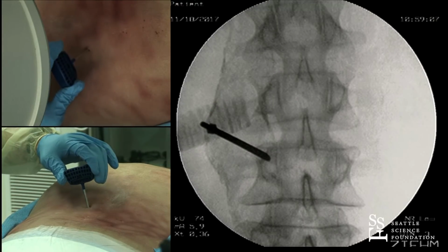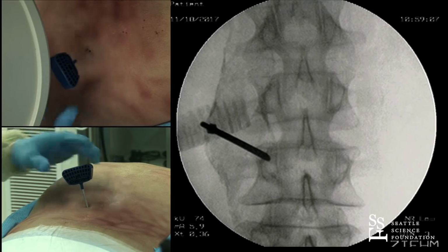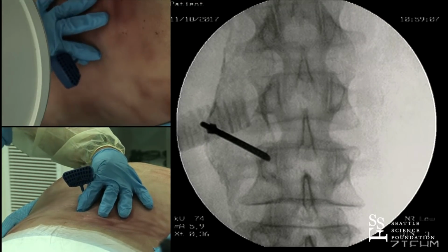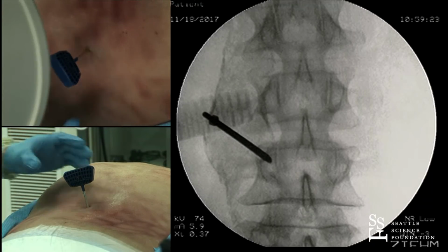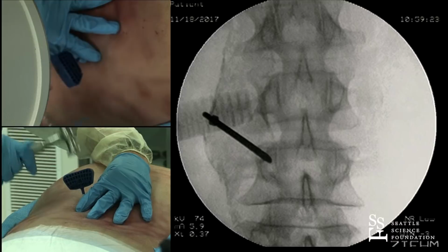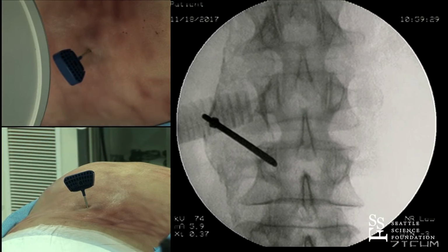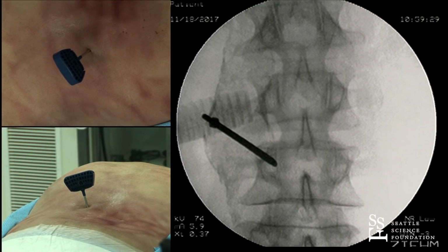So, Doug, for the audience, what are you trying to landmark there? In terms of the 10 o'clock position of that left pedicle, as we hammer this in, that's about the right position. I like that quite a bit. The cadaver is pretty hard. So before we violate the medial wall of the pedicle, we're going to go lateral to see if we're in the posterior portion of the vertebral body. If we are, good. If we're not, we'll do some trajectory altering adjustments.